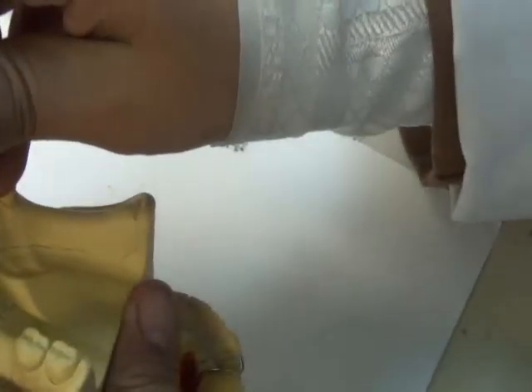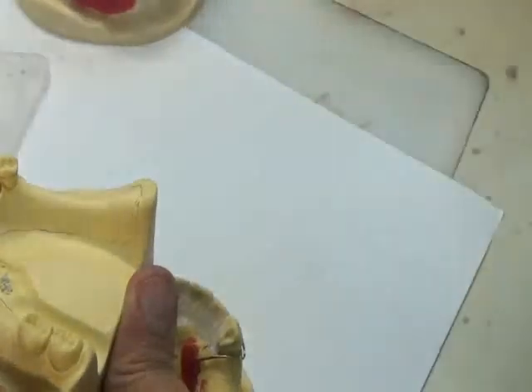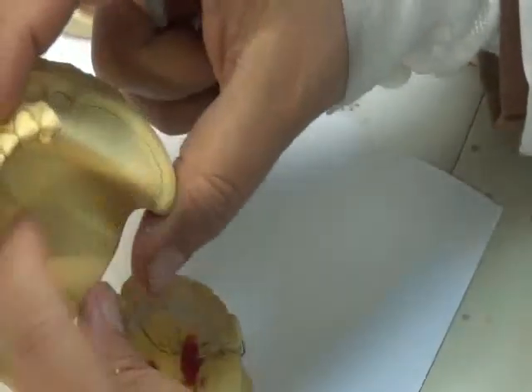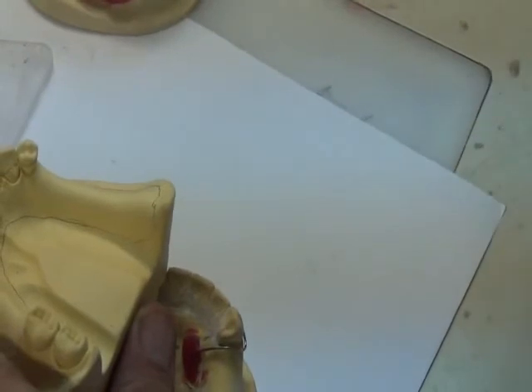So both surfaces now, all undercuts on the abutment teeth, lingually and proximally, have been blocked out, because we want the acrylic going down from one side. We have exposed the survey lines. We call these parallel blockout, because the chisel comes down from the surveyor in a parallel manner, and this space is parallel to this space. So the solid denture can come in and go out without interference from the undercuts. It's done by the surveyor.